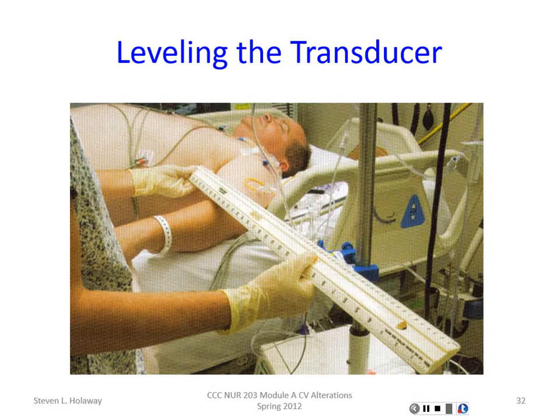They're leveling that transducer to the phlebostatic axis so that it's level. Now, you will see different studies showing different things about where you should measure these. Some say you should measure with the patient sitting at 45 degrees. Some say you should measure it with the patient laying flat. Whatever position you have that patient in, you just need to make sure you have the transducers leveled to that phlebostatic axis. Your hospital will have their SOP on how they want that done at that point in time.